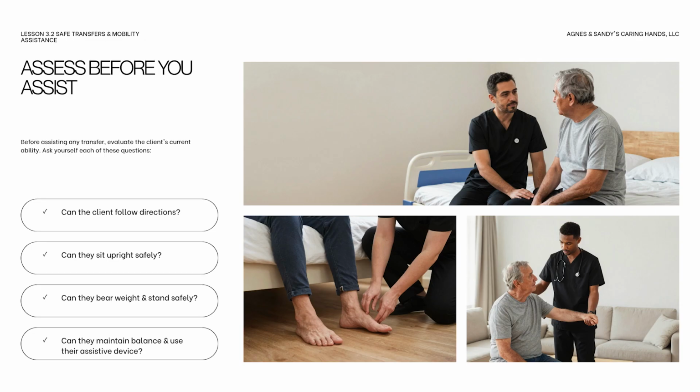Before beginning a transfer, observe the client's current condition. Can the client follow instructions? Can they sit upright safely? Can they place weight through their legs? Do they appear unusually weak, dizzy, confused, sleepy, or unsteady? If the client appears significantly different from their normal condition, do not automatically continue with the usual transfer. Report the change and follow agency procedures.